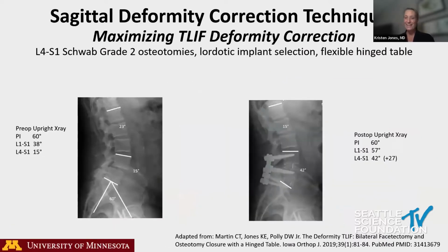TLIF gets a bad name, and it breaks my heart when that happens, because truly TLIF can be quite a lordosing operation. This is just utilizing bilateral facetectomies and also bilateral interbody cage placement, but certainly utilizing the lordosis capability. You can see going from 15 degrees lordosis to 42 degrees lordosis with just a 2-level TLIF there.